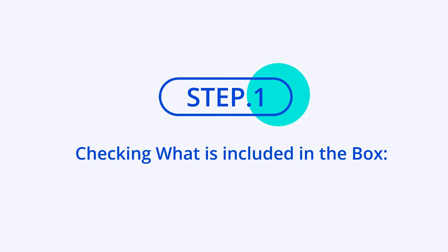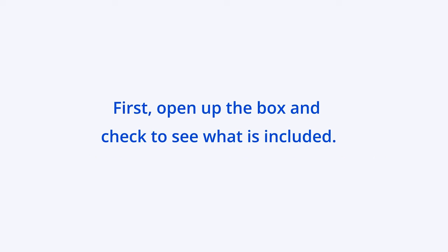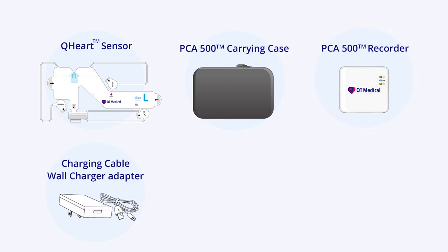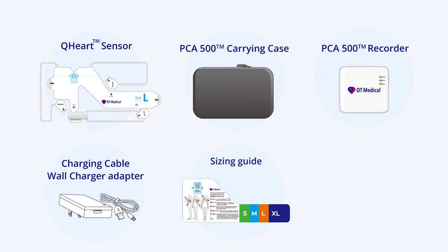Step 1: Checking what is included in the box. First, open up the box and check to see what is included. You will find a Q-Heart sensor, PCA 500 carrying case, PCA 500 recorder, charging cable, wall charging adapter, sizing guide, and quick guide.